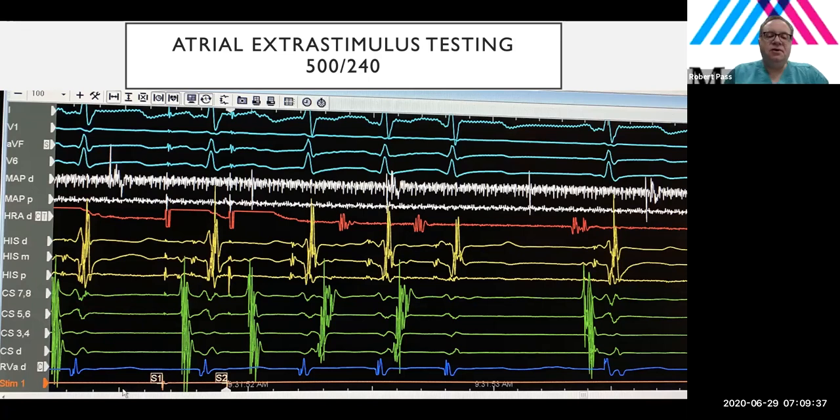That's right. So this is the first evidence in the procedure that the patient has a left-sided accessory pathway, because what's happening is we're going A down the AV node, HV, and then it's re-entering and coming up an accessory pathway. And the reason we know it's coming up an accessory pathway is because the earliest retrograde A is actually located in the distal coronary sinus pair.